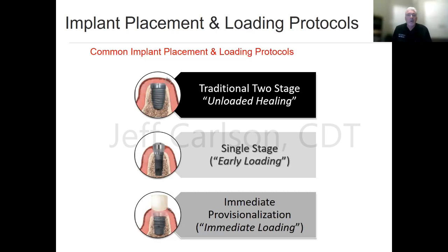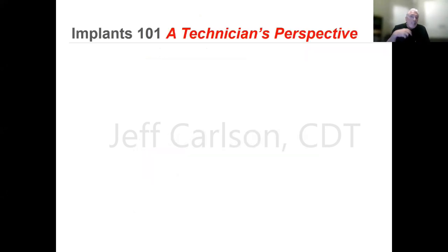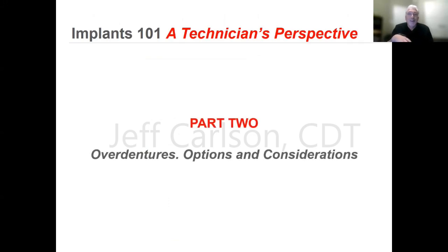And the thing we don't want to do is have implants fail, because usually when they fail, it can cause more trauma to the surrounding bone. And you may not be able to do something as simple as replace that implant with a wider implant. It may need bone grafting. And now you're talking to a patient about more time, delays, and it's hard for you to charge them for those things. But anyways, things to think about. So that was a very quick recap.